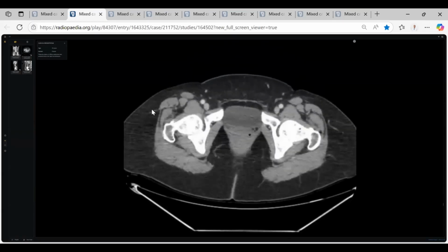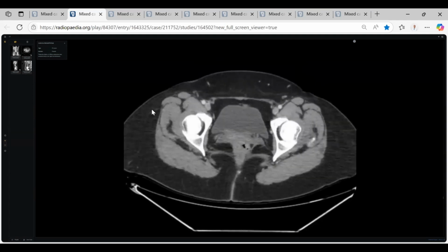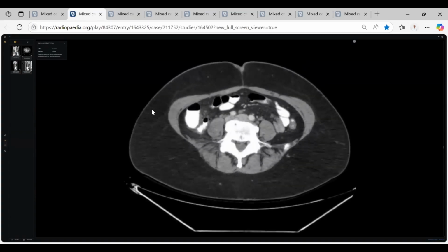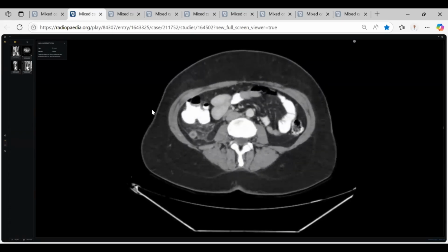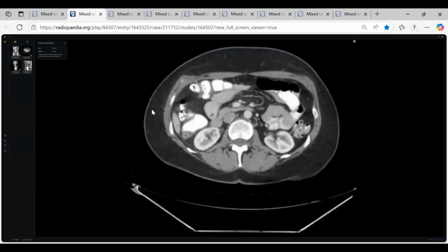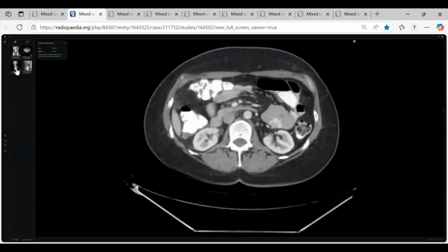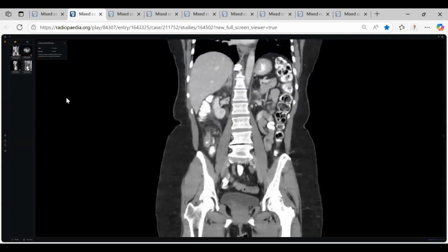Okay. This is a pelvis CT scan. I can see that the hernial orifices appear intact. I noticed that there is dilatation of the tubular blind-ended structure seen in the right iliac fossa, which is surrounded by smudging of the surrounding mesentery, and there is also sub-centimeter lymph node enlargement.